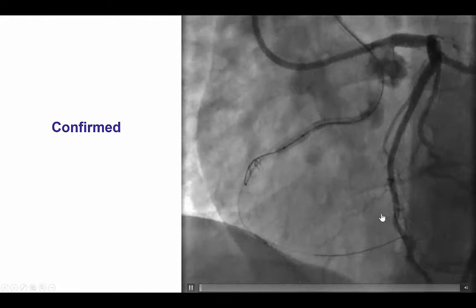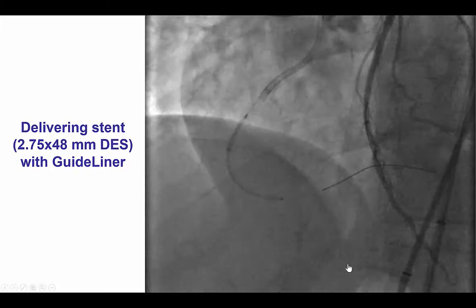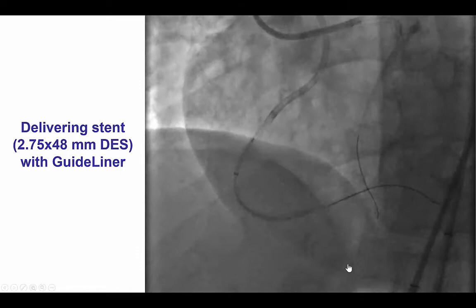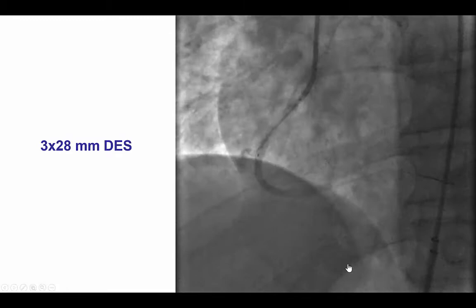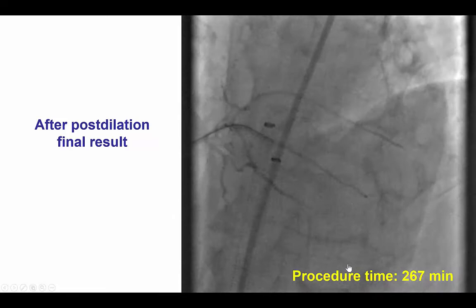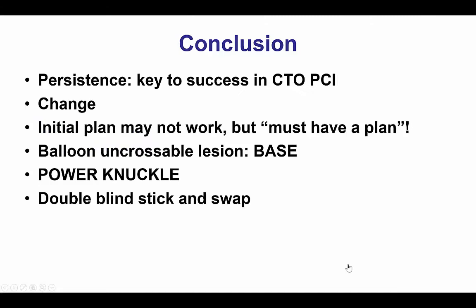Distal true lumen position was confirmed with contralateral injection, and we then predilated the lesion. We delivered several drug-eluting stents, which was quite challenging due to the calcification and tortuosity, but was successful using a GuideLiner, covering essentially all the way to the proximal right coronary with an excellent result and TIMI-3 flow into the distal vessel. It was a long procedure at just over four hours, but an excellent final result.